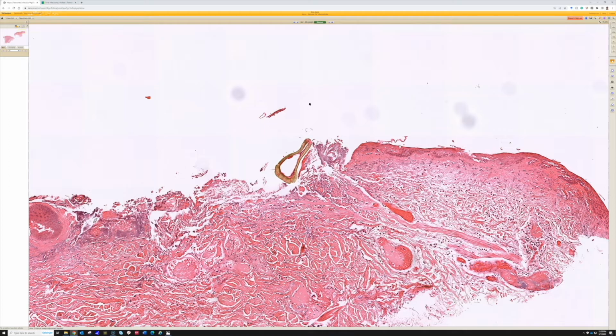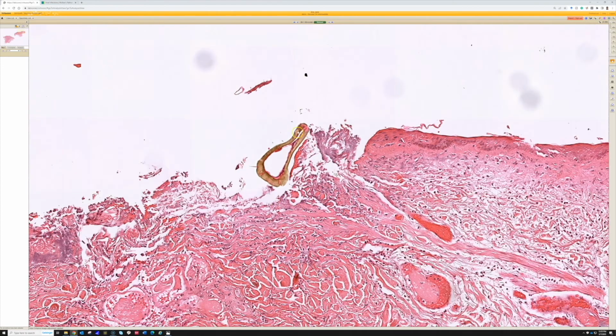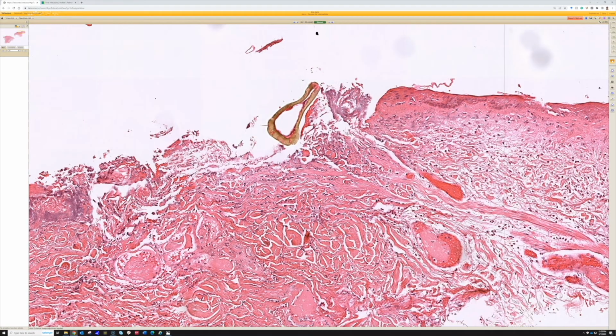So that's another time you can see arthropods microscopically that probably are not what's causing the problem in the patient. Whether those are fly larvae, maggots, little gnats, or other small environmental insects that got stuck on the oozy surface of an ulcer, those are things that could sometimes come into the differential. But in this case, it fit for tick, and that's morphologically compatible with the tick mouthpart.